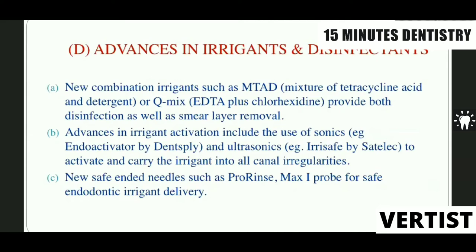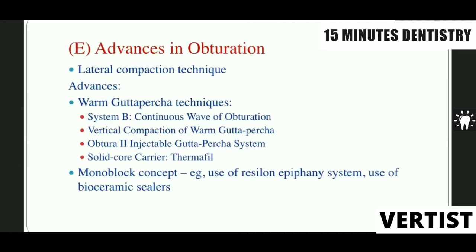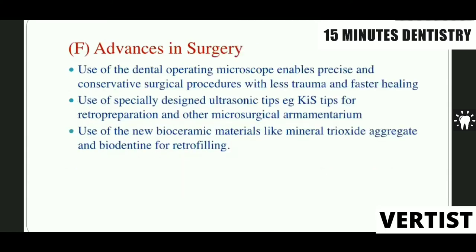You have the combination of MTAD, and we have different irrigation activation systems like your Irrisafe and EndoActivator, Max-i-Probe, and different delivery and agitation systems, which are briefly noted there. Obturation, we have the thermoplasticized obturation techniques, and these are very popular. And this is, again in obturation, an important question that will be asked. So you could also include additional vertical and other methods of obturation which have been explained. You could also add additional thermoplasticized methods in that.